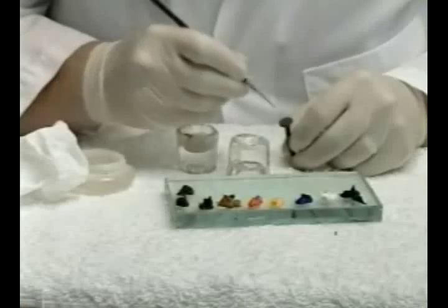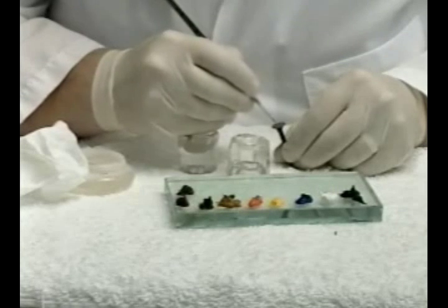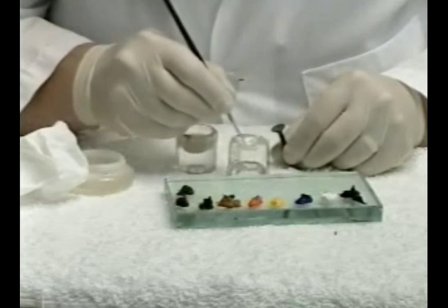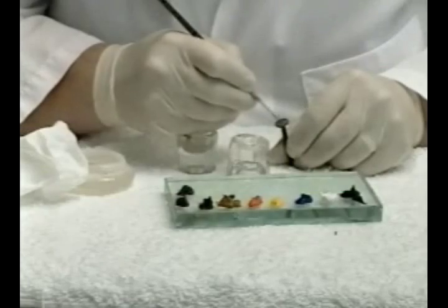After the ocularist is satisfied with the impression, they will determine the proper pupil location for your artificial eye by matching it with your good eye. The next step is the coloring of the artificial eye. In order for your ocularist to best match your eye color, wear neutral tones such as beige or white. Bright primary colors reflect and bring out tones from your eye that are not always evident. The ocularist may also study your eyes at length in order to properly match the details and patterns of your iris. A pupil size is chosen that most closely matches your pupil size in normal light.